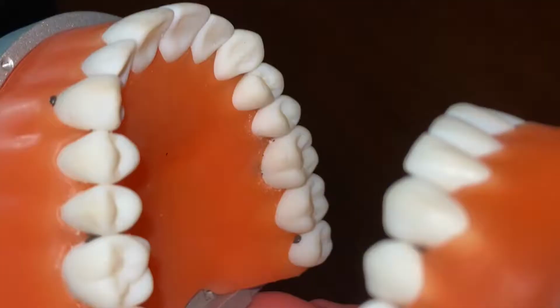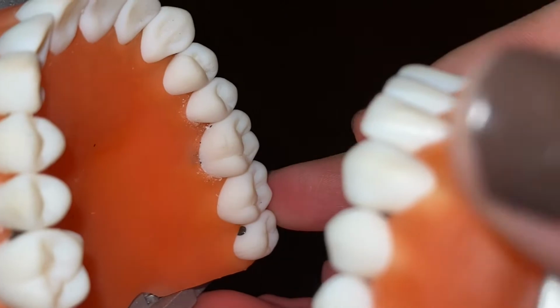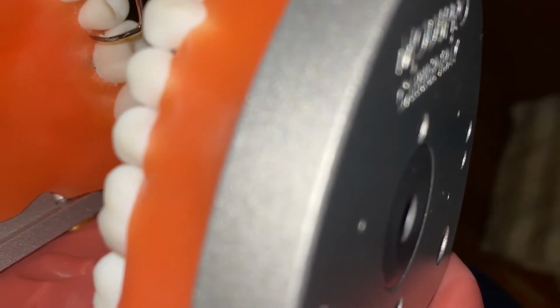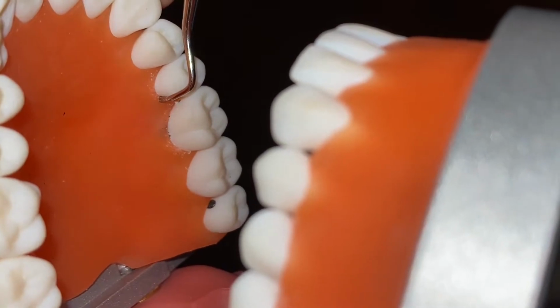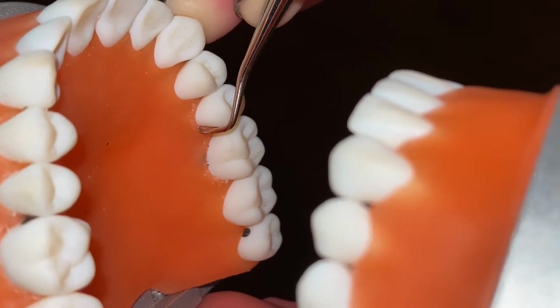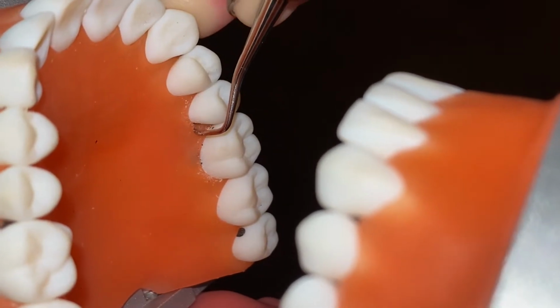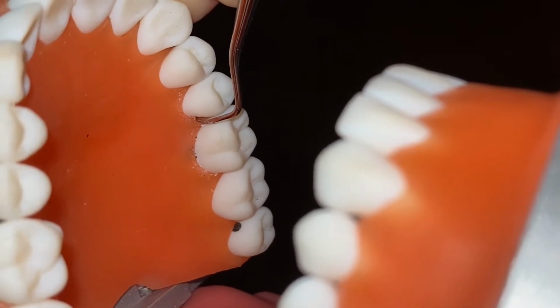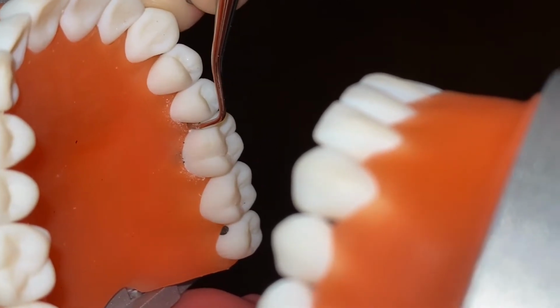Removing. Okay, now going to tooth number 13 here. I am going to fulcrum about 2 teeth away, inserting my blade as close to 0 degrees as possible, opening it up, and then now I can scale towards the distal by just doing up-down motions with my elbow. Up, down, up, down, pivot, roll, up, down.